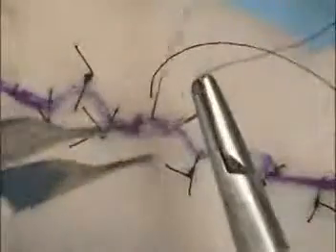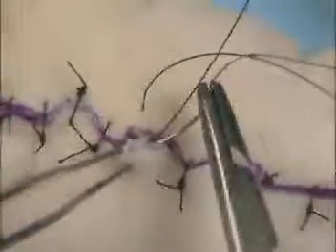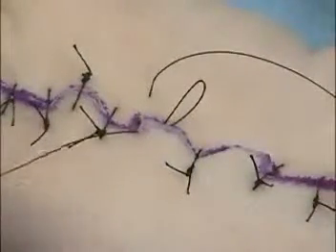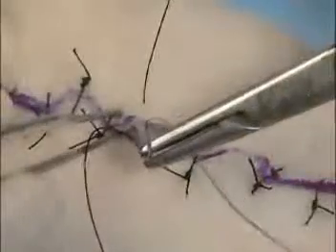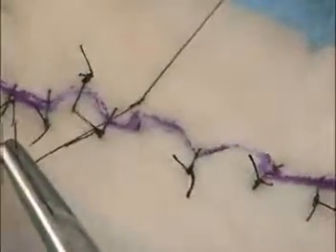Here we can see in this particular example the corner suture is being placed so that it does not interfere with the blood supply of one limb of the flap. There the corner stitch is put into position. It now comes out through the skin on the opposite side so that the closure can be made without interfering with the blood supply to the delicate tip where the incision had been previously placed. So there's an example of a corner stitch.